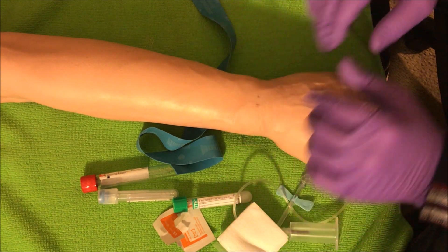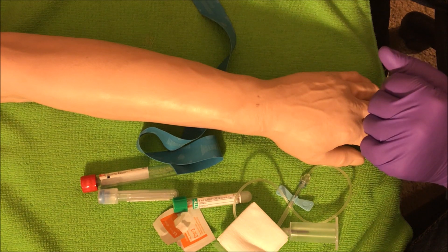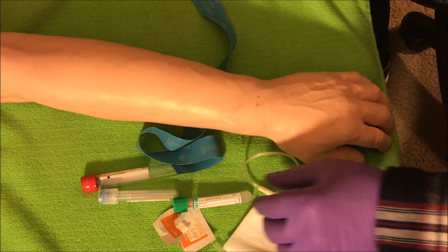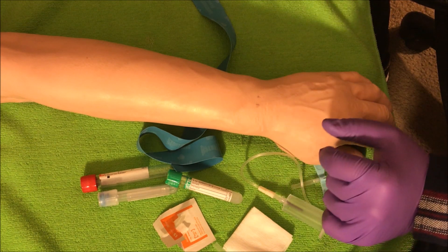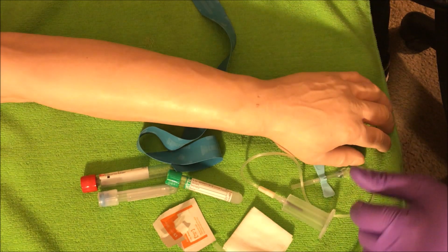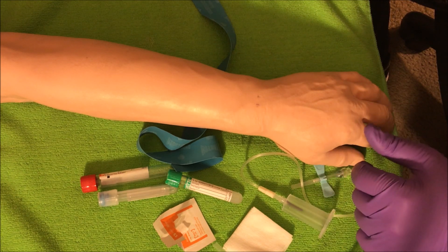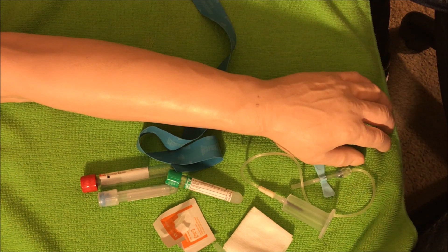So there should be no difference with a hand draw. The butterfly draw is really easy and simple — the devices are great and easier to use. The order of draw can change: if using a light blue and a red top, use the red top first to get the air out, but three to four inches and everything else is the same. I hope this helped with your butterfly draws. Leave any questions in the comments or email me.